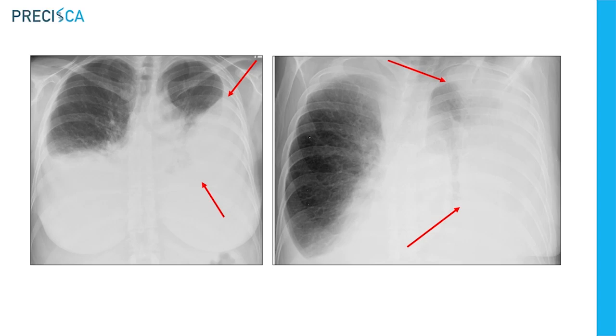This is a patient on their left side. And you could see they're lying on their left side. The arm would be up this way. And this fluid now has shifted. This is the same patient with the same amount of fluid. But because the patient is lying on their left side, the fluid is shifting around. And we still see some aerated lung tissue. That's the black part. And this is the right lung, which is the lung on this side.